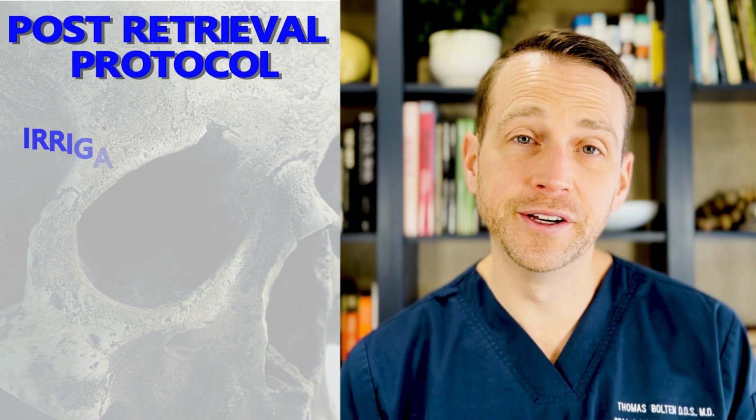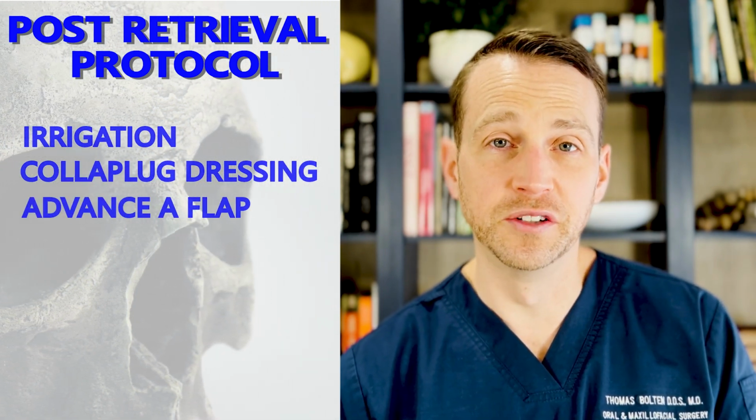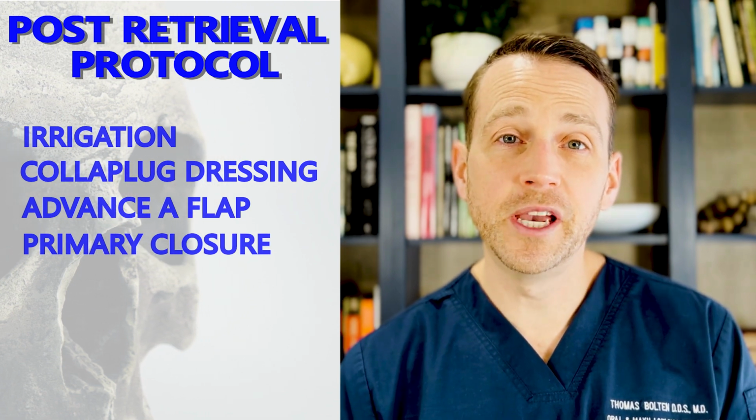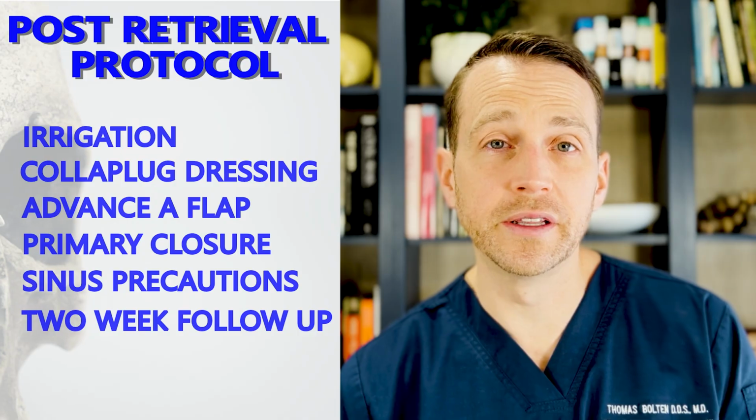Thankfully, this move worked. I took a sigh of relief, irrigated, placed the collagen plug, and then advanced a small mucoperiosteal flap to get a nice closure. I placed the patient on sinus precautions and then saw him back 2 weeks later to ensure appropriate healing.